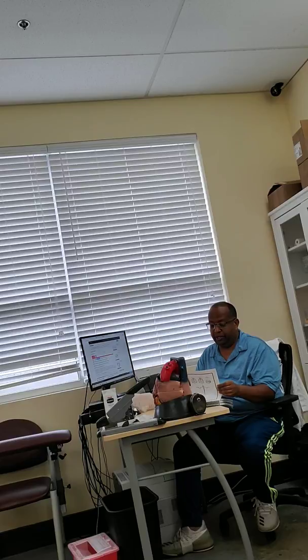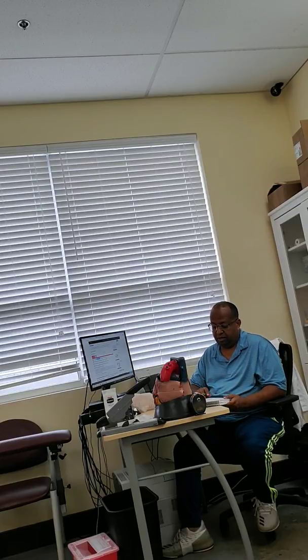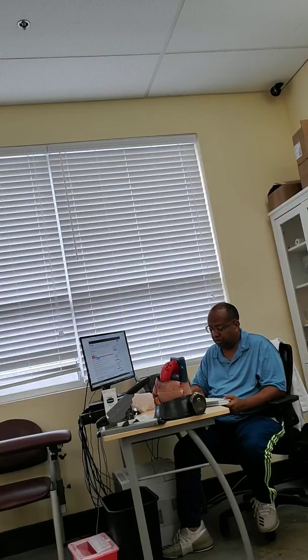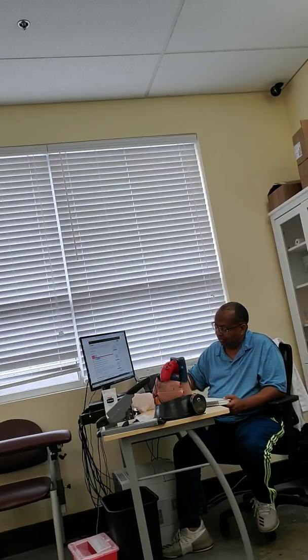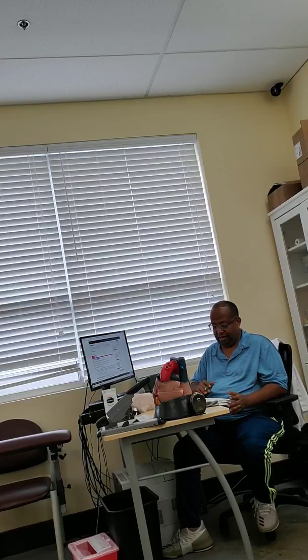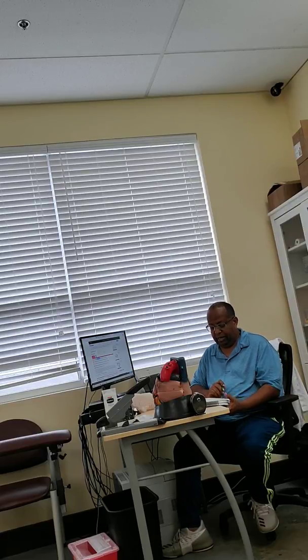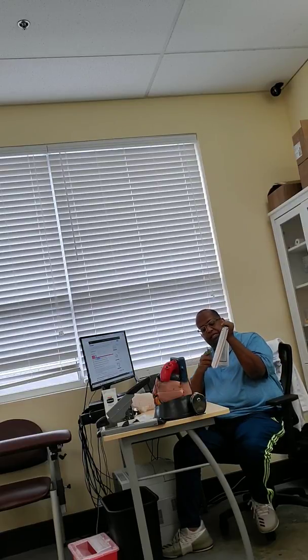Then let's go to page 118. You can see a normal heartbeat, how it looks. Now tachycardia, fast heartbeat, look how it looks. Bradycardia, look how the spaces are wider. Can you see? When it's tachycardia, the spaces are closer. And arrhythmia is irregular, like that one. Look how the spaces are different. This picture shows how the atria are stimulated, now ventricles, now the recovery phase, repolarization.